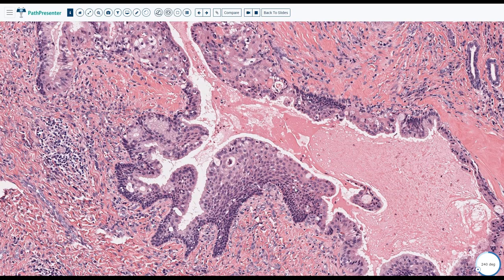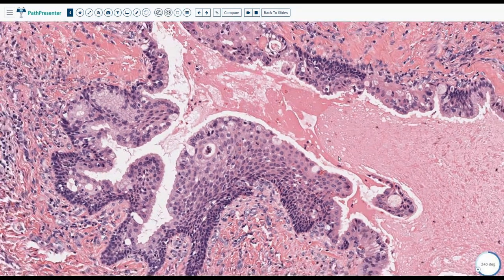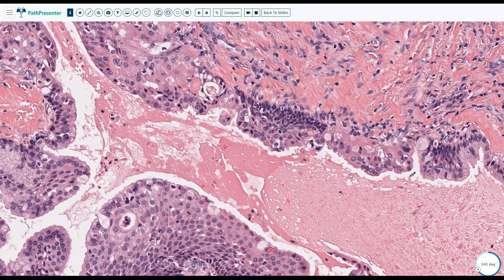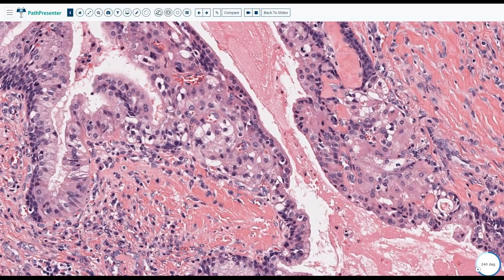All right. So yes, one of them is keratinization. I don't see it, because these cells are not really squamous. They are epidermoid or squamoid, not real squamous. So first of all, I don't want to see keratinization, and again, we don't say never, but I would say it is like one case that an expert will see and it will be proven to be mucoepidermoid carcinoma. So I would say for our level, never.